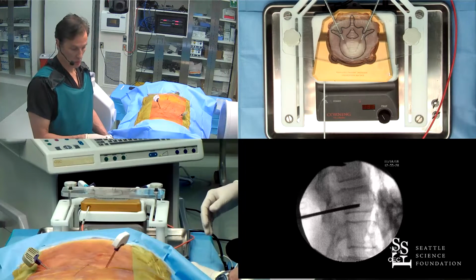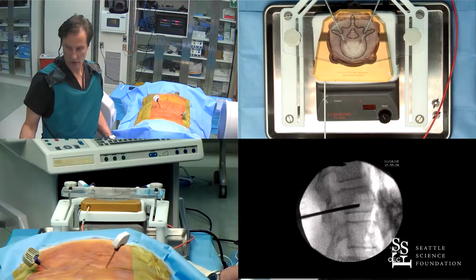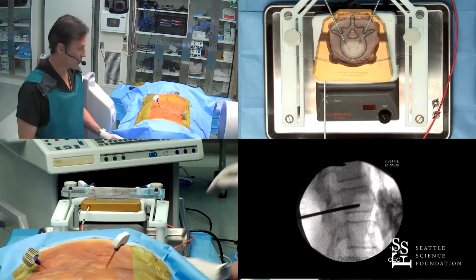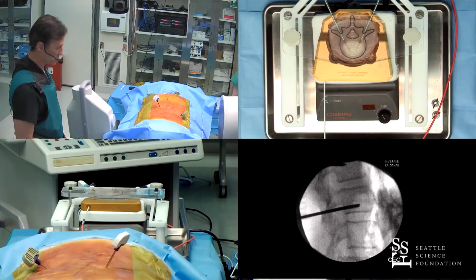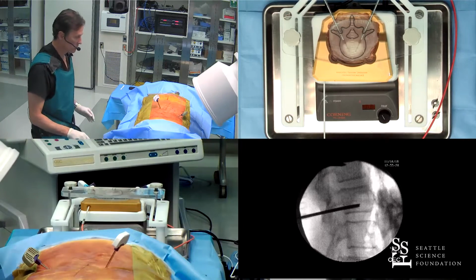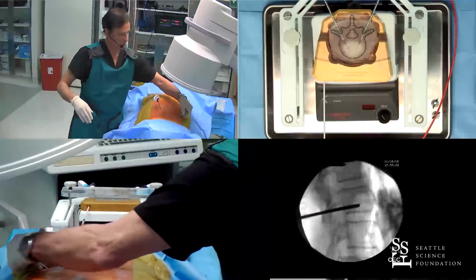So we have completed our ablation procedure. I want to do one more approach, and then I will re-access that transpedicular approach, and we will do the balloon kyphoplasty on that side. So just leave it about 30 degrees towards you.